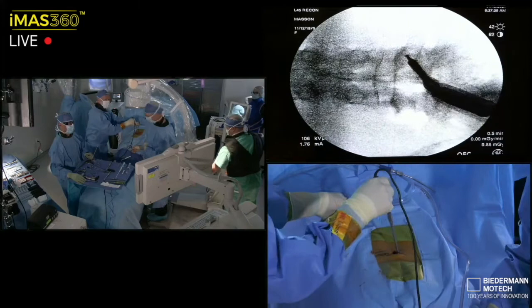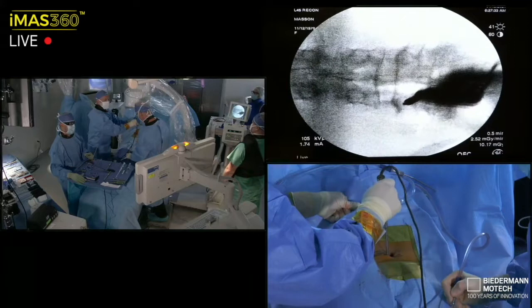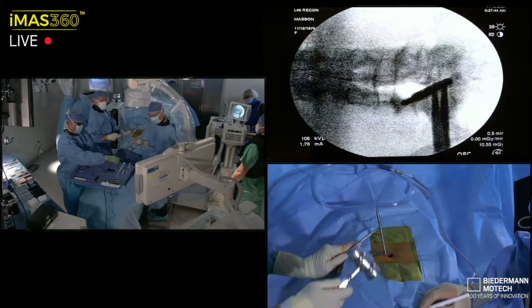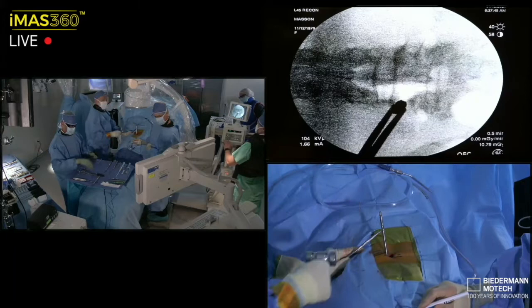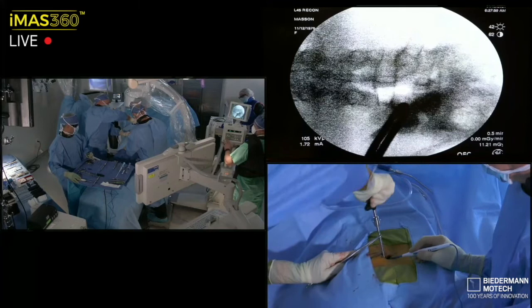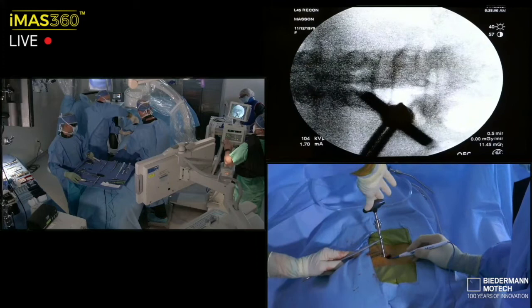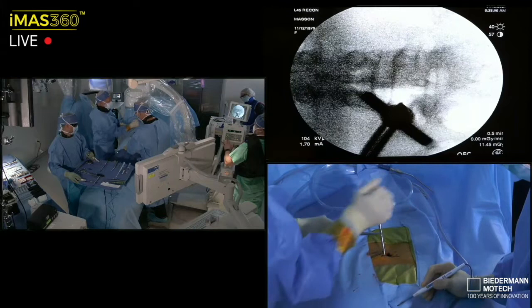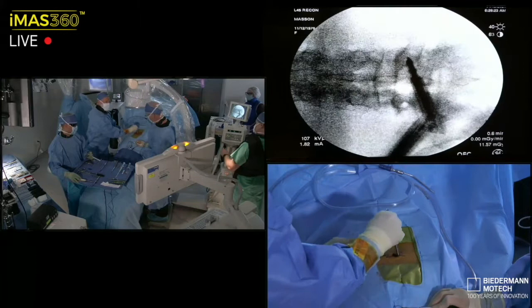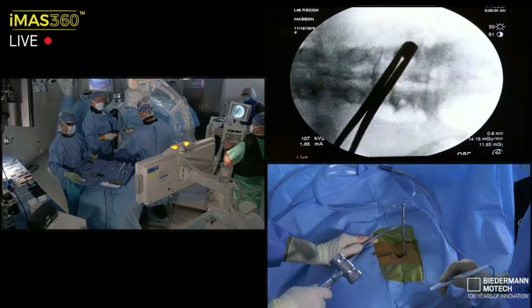All right, we'll find a spot right at the pedicle map, L5 right. Same exact thing, L5 left. Okay, we'll get our angle. Bone quality is actually outstanding. That's good news for her. So these taps are nice and sharp. I go straight tap to screw. As stated previously, the accuracy early is key in this methodology.